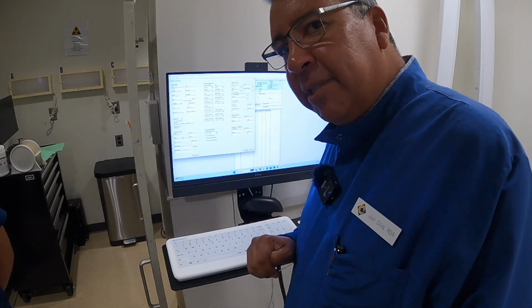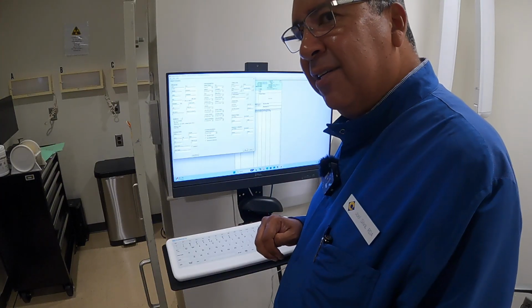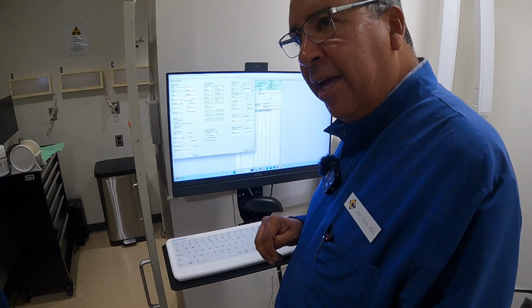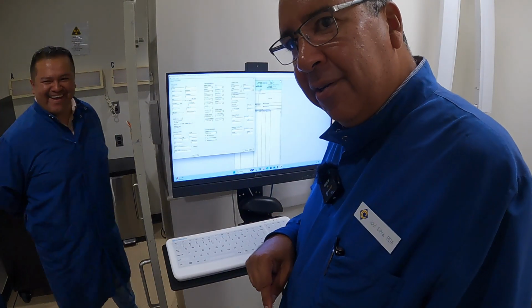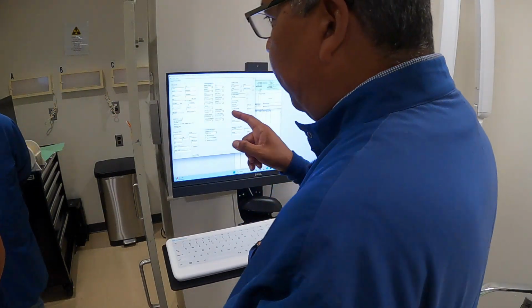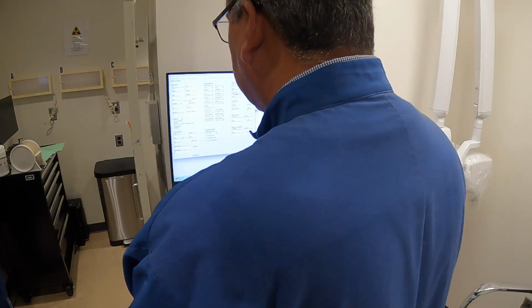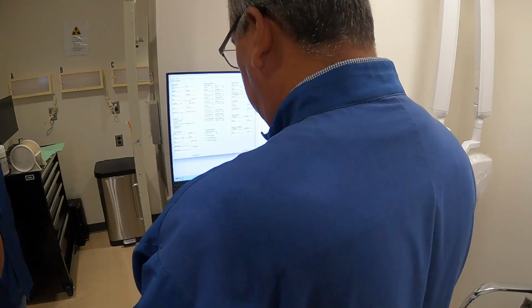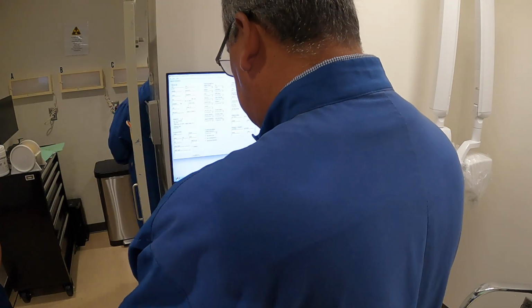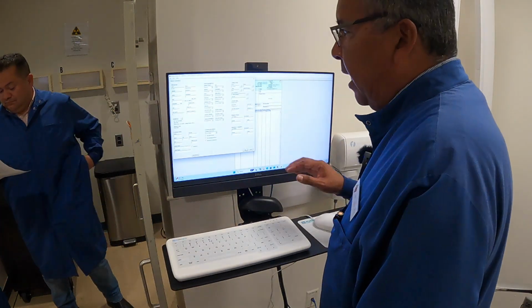I love this because I'm going to be saying this over and over again. Starts with the B as well. Bisecting. And the other technique that we're going to learn later? Paralleling. Okay. So you're going to be doing bite wings, and then you're going to be doing the, maybe I'll put it right here, bisecting right there. Okay, that's pretty much it.